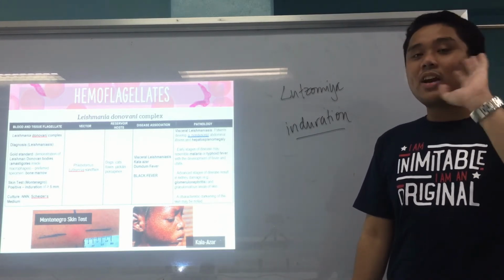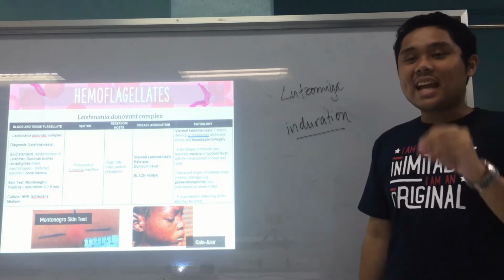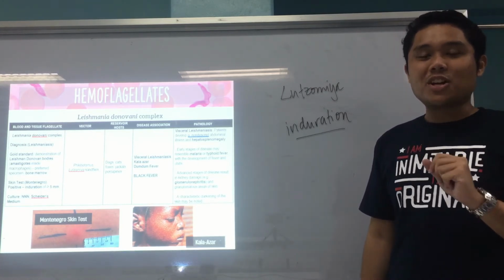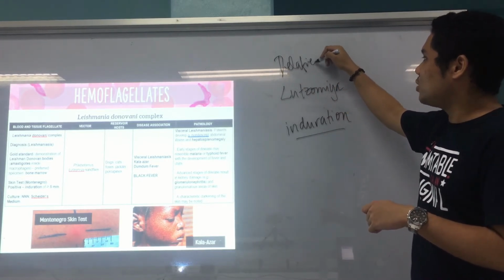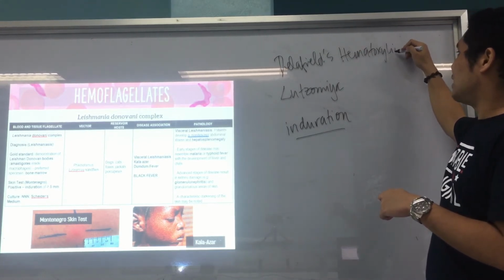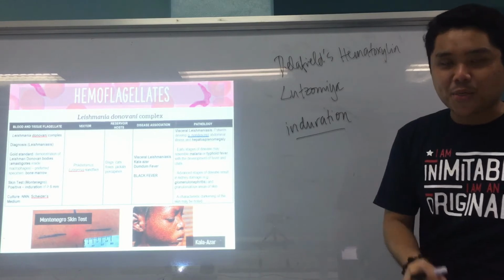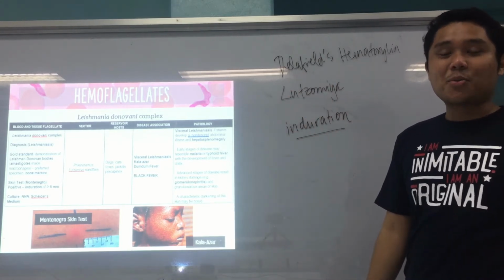Alright, before I forget, recall, what is that stain for filarial worms that Liman could mention? The stain that is used to demonstrate the sheath, right? Recall in our staining, what is that? It's your, what is the name, letter D? It's your Delafield's hematoxylin. Basta if you want to stain the sheath, you use Delafield's hematoxylin. I hope that buzzword pushed through, I hope you still remember. Delafield's hematoxylin, for the microfilarial sheath. Okay, I should have inserted that in the filarial worms video.